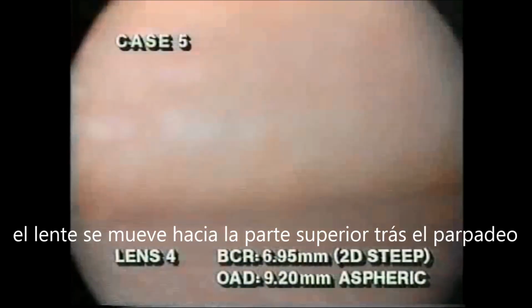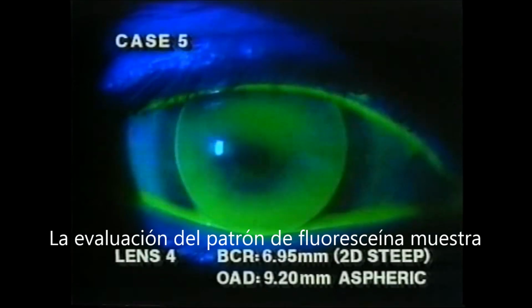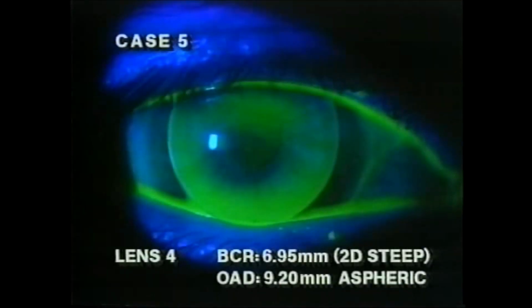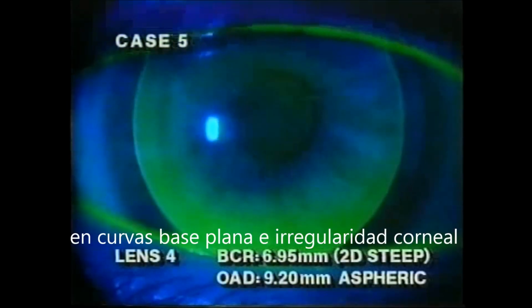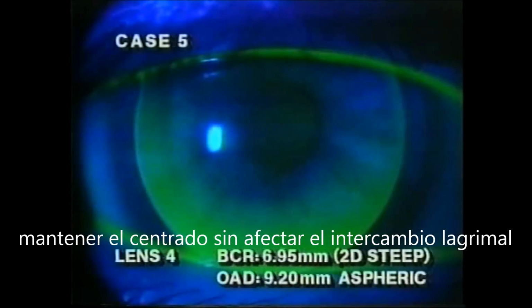As the lens moves superiorly with the blink, excessive edge lift is observed inferiorly. Fluorescein pattern evaluation reveals a flat lens to cornea fitting relationship with excessive central bearing. The inferior pooling is characteristic of a flat base curve on an irregular cornea. The high eccentricity lens design would require a steep base curve radius for paracentral and mid-peripheral alignment.